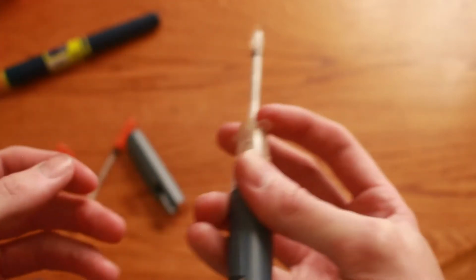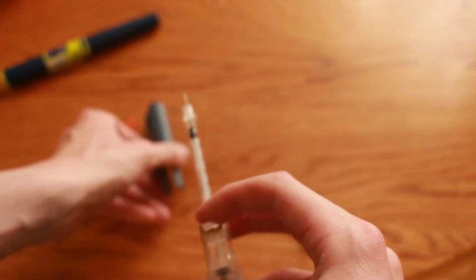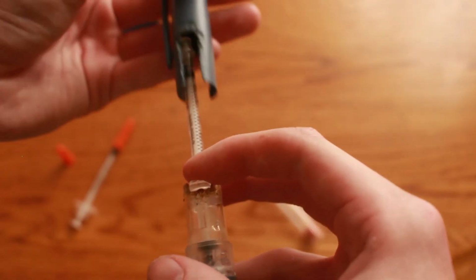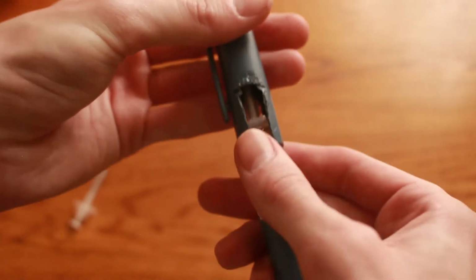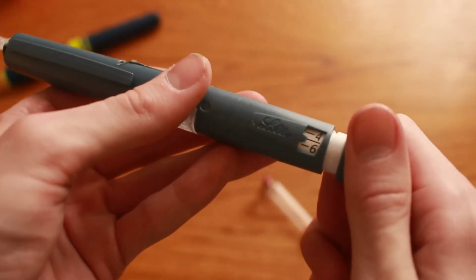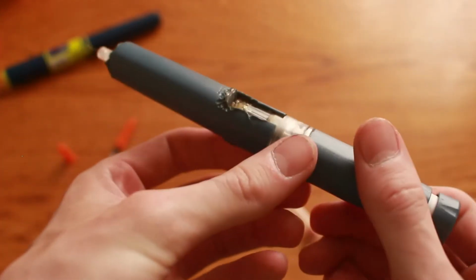And you might be thinking, well, this looks a little inconvenient. It's a two-handed job, just like with the chain link one. But it's actually not. If I put this cap back on here, press it down, then it stays completely stable. I can take, let's say, half a unit, press it, and it stays like that.